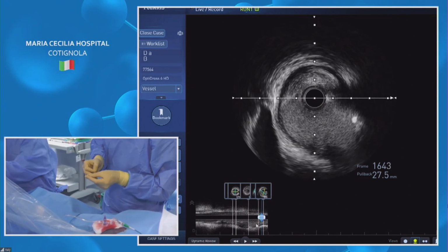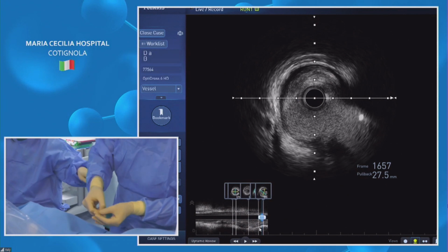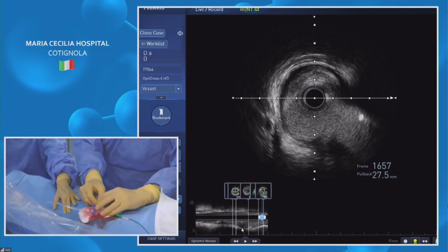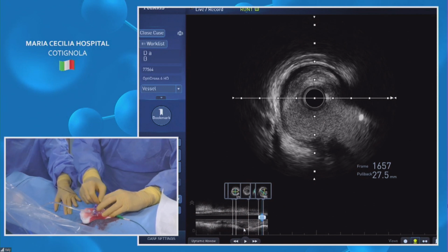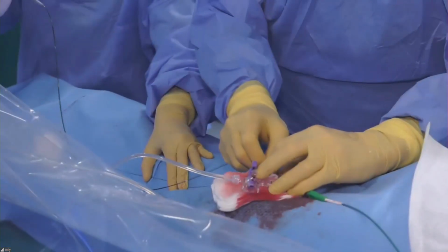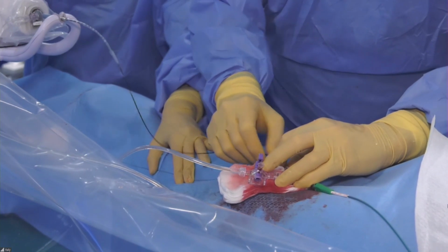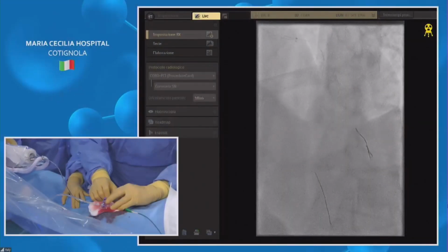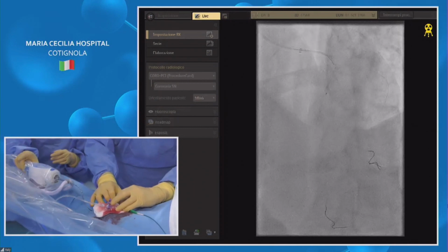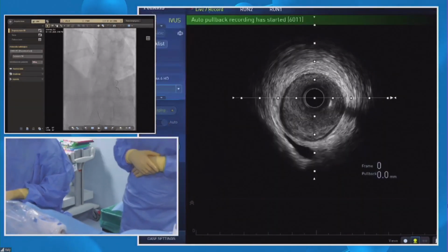Okay, so you would position it ostially? I'm actually not very clear about the image. That's why I withheld my comments. So your next step is what now? I'm just looking better at the left main because by any of the criteria that we have used, just having plaque does not mean that we ought to place a stent. Yeah, so here we have still plaque, I would say a lot.